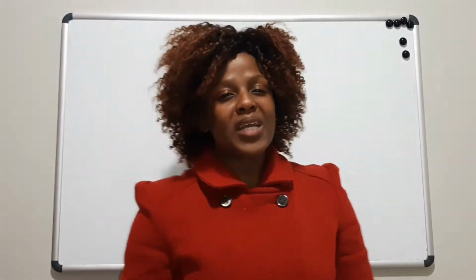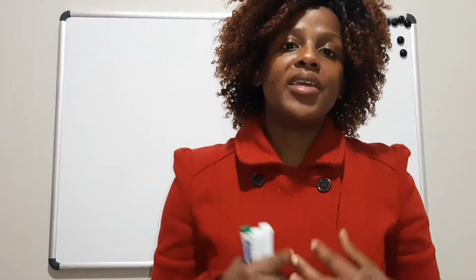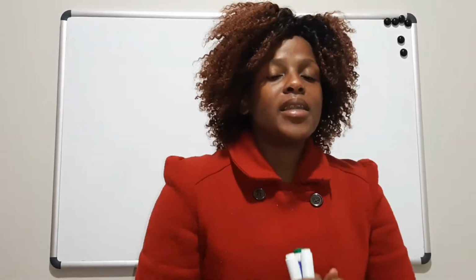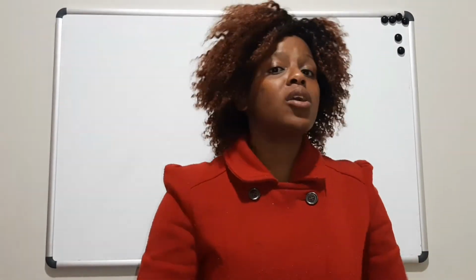So today we are going to talk about receiving samples in a chemical pathology laboratory, because it's very important that we make sure that the sample that we receive in a laboratory is in a proper state and is the correct sample, because having an incorrect sample or a sample that has deteriorated can affect the result of the patient, which can lead to incorrect treatment as well.